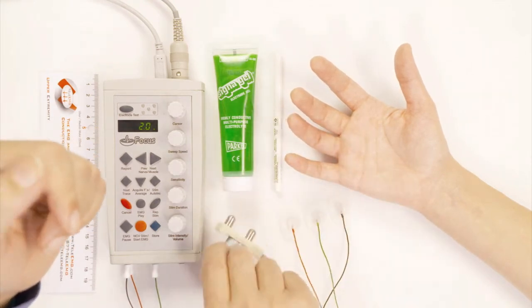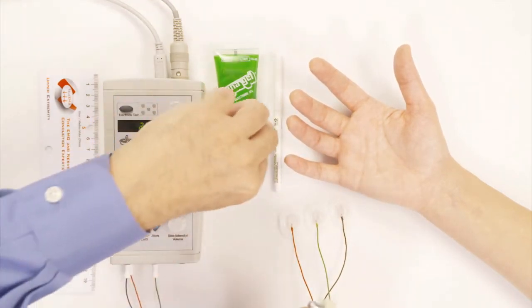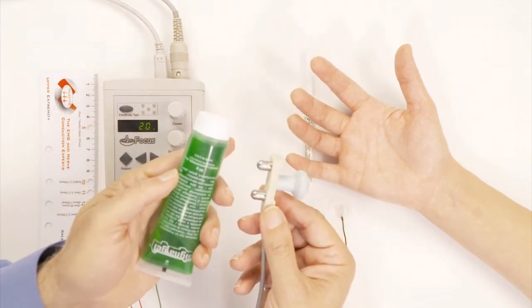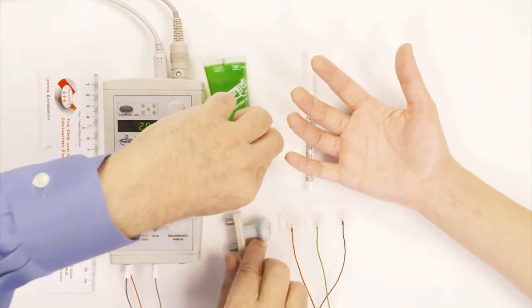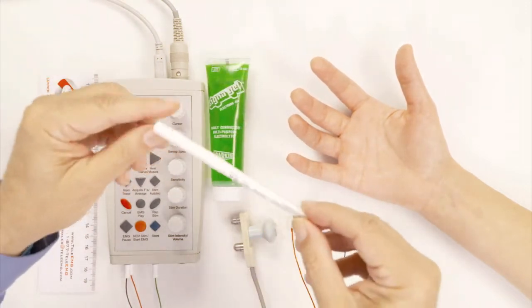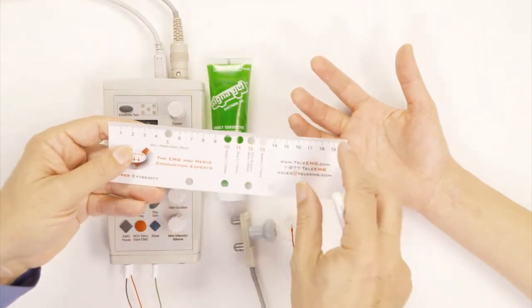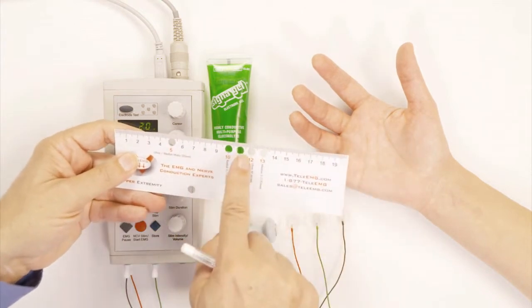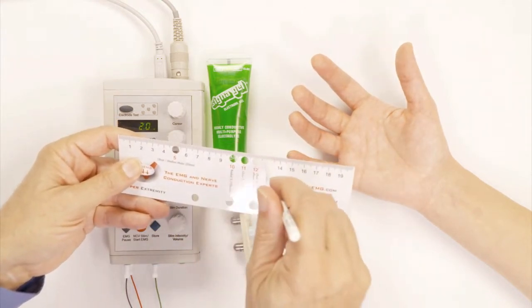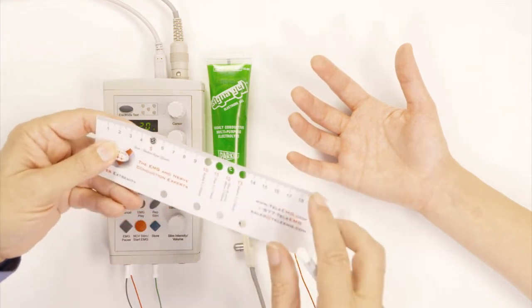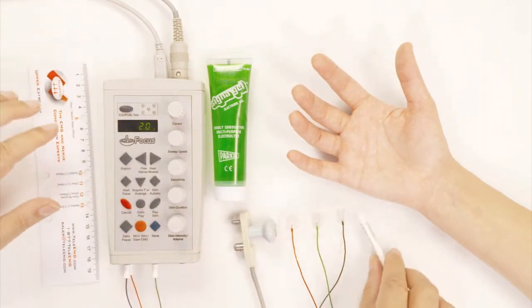Finally, in order to make sure that the electricity goes from the stimulator to the skin, we're going to use some gel, which you see here. And also, in order to measure, we're going to use this ruler right here. And as you see, the ruler has holes in it to eat for each nerve. And I will be putting the marker through the hole to actually mark the place where I'm going to be stimulating the nerve.